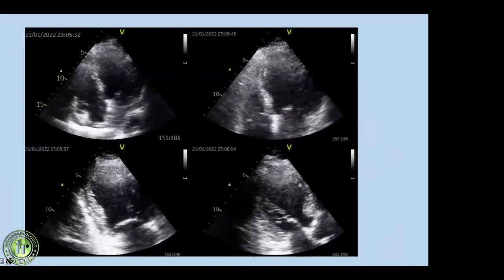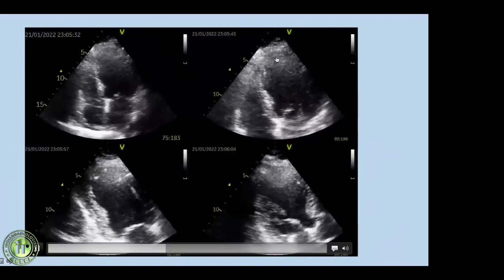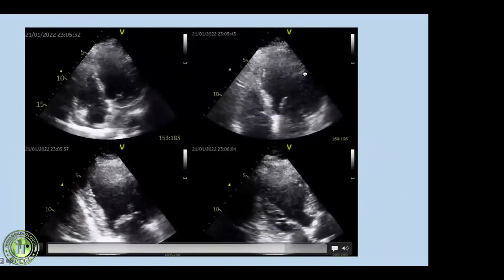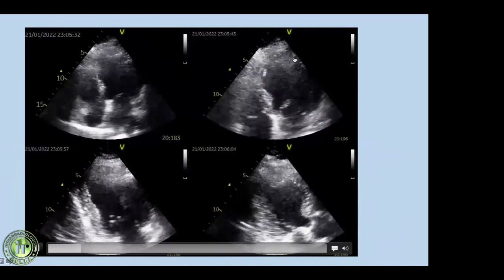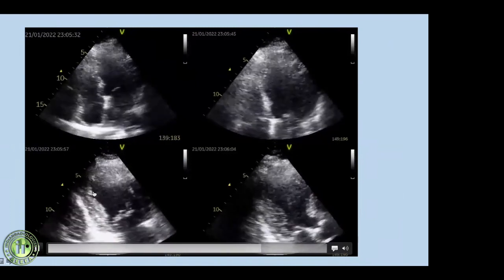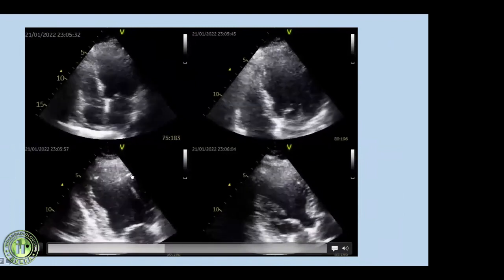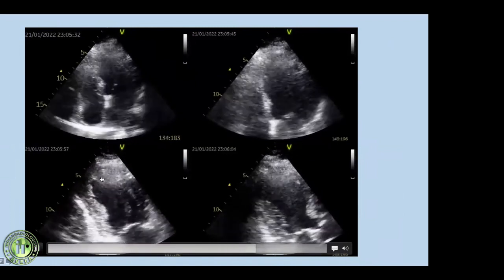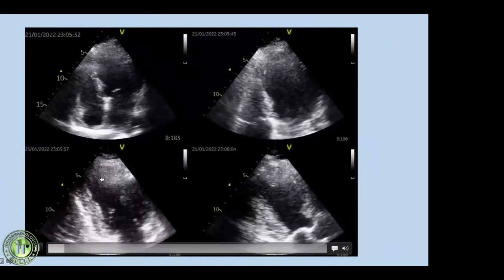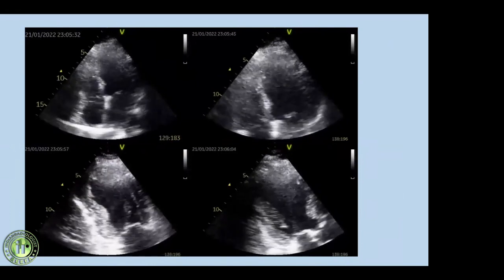The ECG from V1 to V6 showed ST-segment elevated MI — confirming transmural scar. On 2D echocardiography, the apical portion and partly the septum were not moving, showing akinesia of the apical segments. This fits into LAD territory.